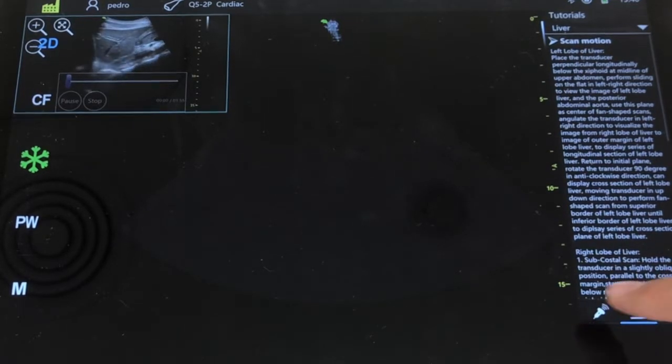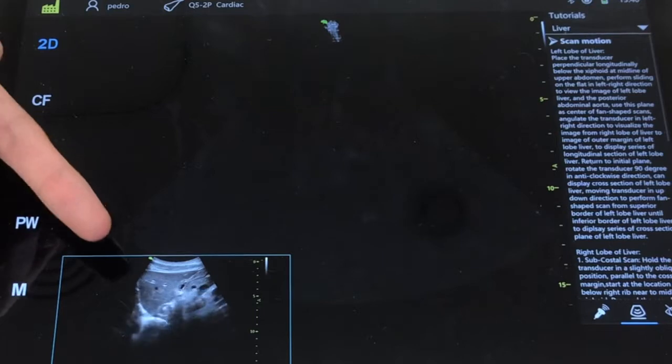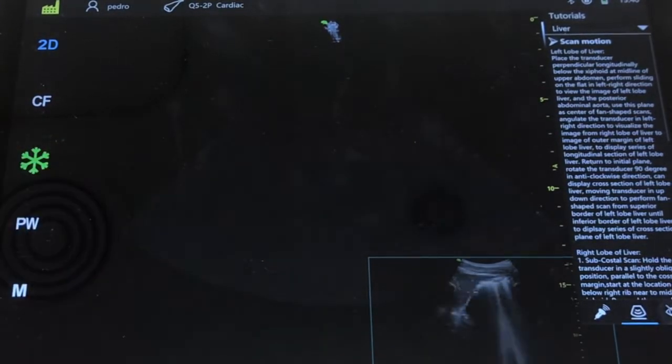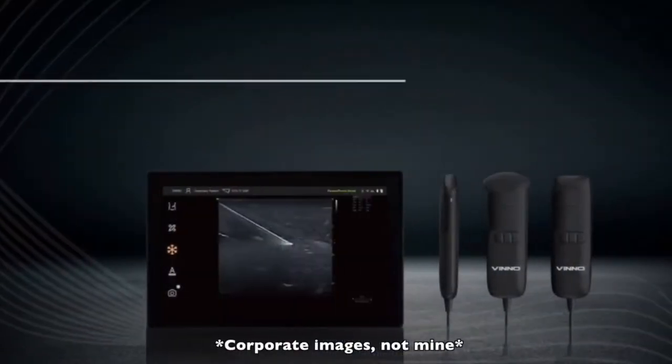I would like to mention that, contrary to other devices I've already reviewed on this channel such as the Vscan Air, Butterfly, and Clarius, given that it cannot be plugged into your smartphone, you won't have the WhatsApp, Messages, Telegram, or other messaging app sharing options that you use conventionally — which would be the most useful channel in case you want to quickly share an image with your co-resident or one of your peers.